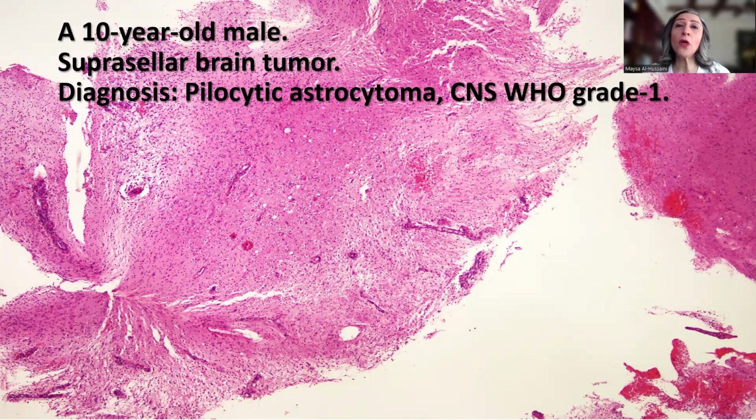Now, the presence of other worrisome features like the microvascular proliferation loses its significance in the context of pilocytic astrocytoma. So before we assign this tumor into a grade 4 because of the infiltrative growth pattern, because of the absence of the typical features of the pilocytic astrocytoma, and because of the presence of the microvascular proliferation, remember that supratentorial tumors in children are likely to be pilocytic astrocytoma, which might show the diffuse growth pattern, so this is the important pitfall that we should pay attention to.